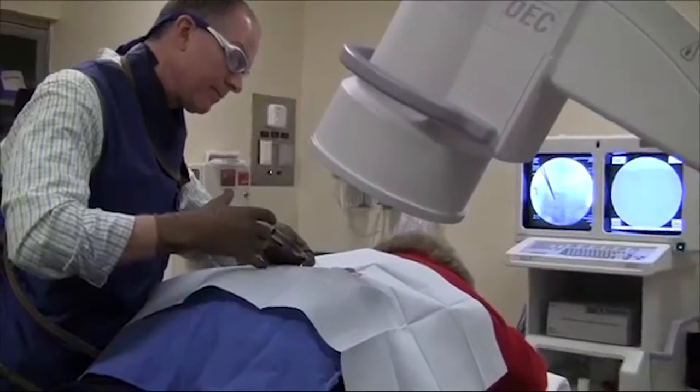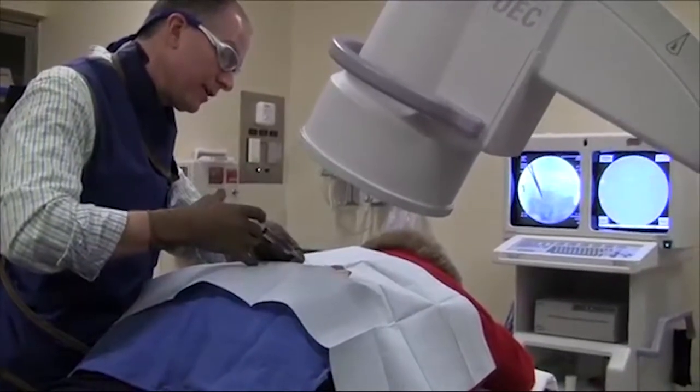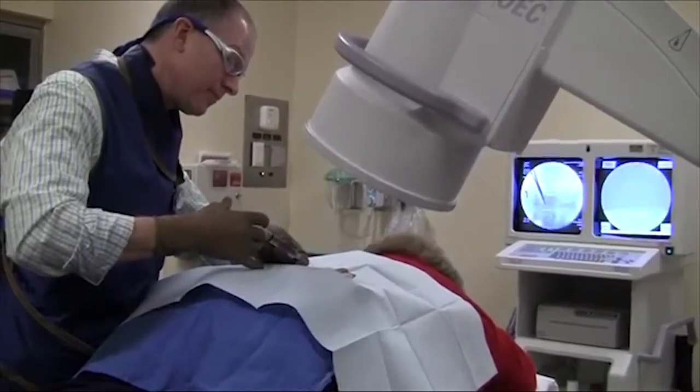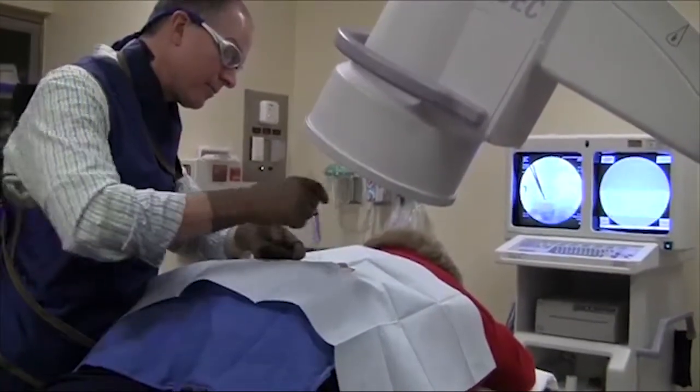Once the exact location is identified, the patient is injected with local anesthetic.